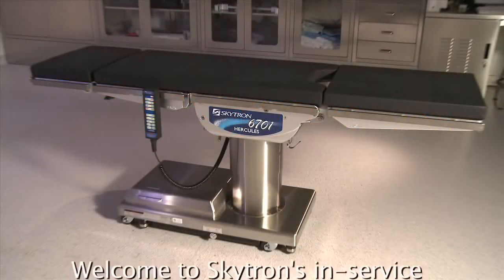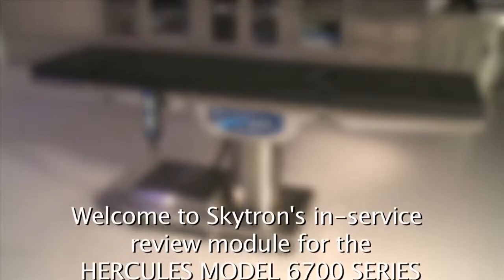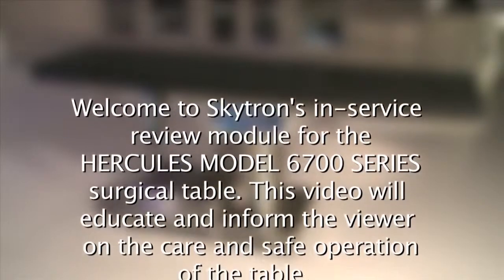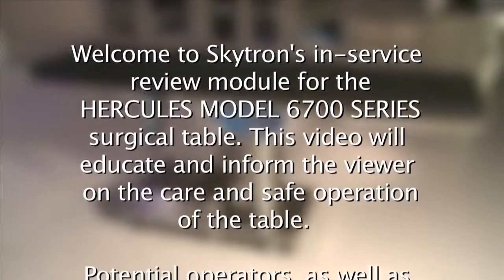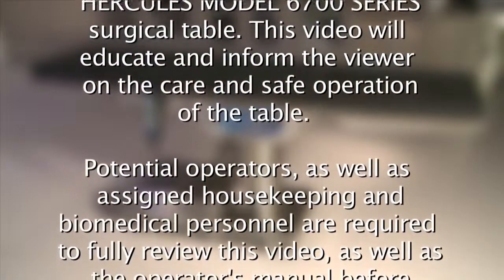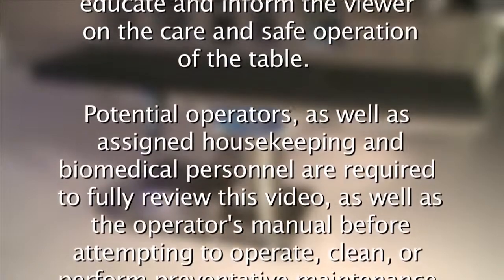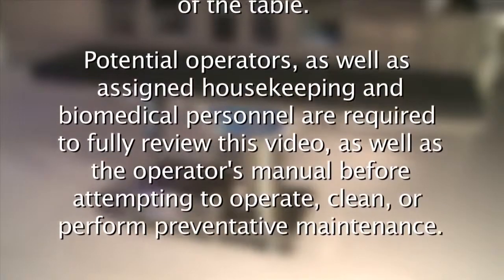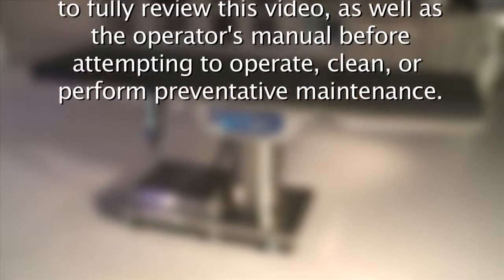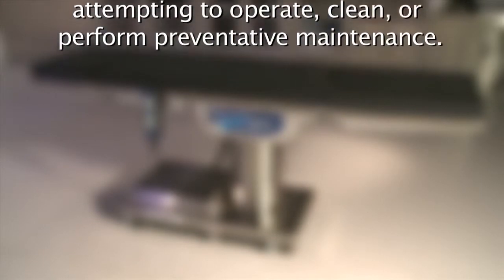Welcome to Skytron's in-service review module for the Hercules model 6700 series surgical table. This video will educate and inform the viewer on the care and safe operation of the table. Potential operators as well as assigned housekeeping and biomedical personnel are required to fully review this video as well as the operator's manual before attempting to operate, clean, or perform preventative maintenance.